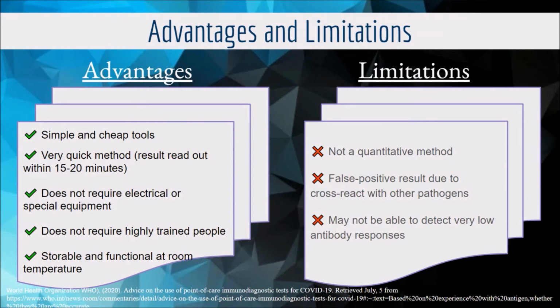So this RDT is easy to handle as it can be run without the need of any special equipment or electrical supply. Next, RDT also does not require any highly trained staff to conduct the test, as anyone who is knowledgeable or anyone who knows how to use the tools correctly and read the result can actually carry out the test. And lastly, RDT does not require a certain temperature to store the device, and the test can be run just at room temperature, which facilitates the testing outside of laboratory settings.